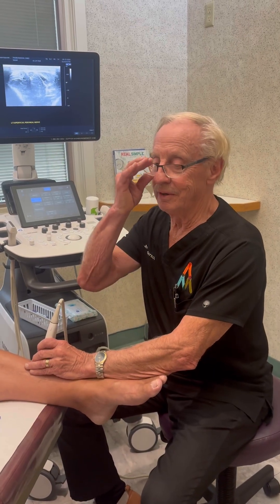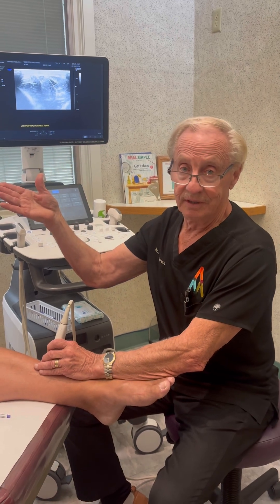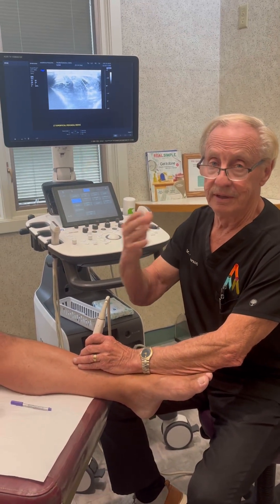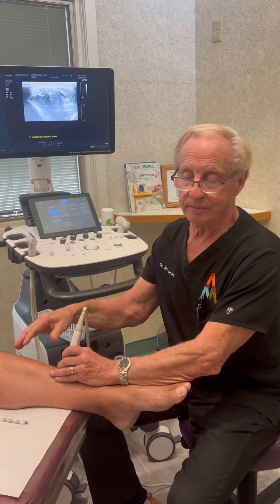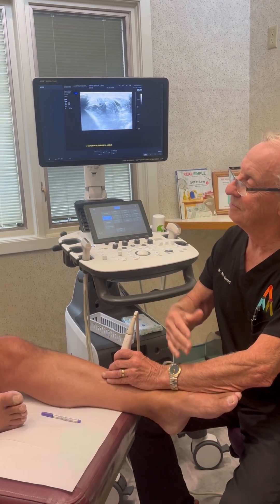Hey guys, Dr. Anderson here. I'm holding an ultrasound machine, and I'm going to introduce Chris — he came all the way from Pensacola, Florida. He drove here with hopes of reversing his wrist and leg surgeries, which are planned for tomorrow. I'm going to show you something with this ultrasound, but first — how did you find out about us and decide to come?